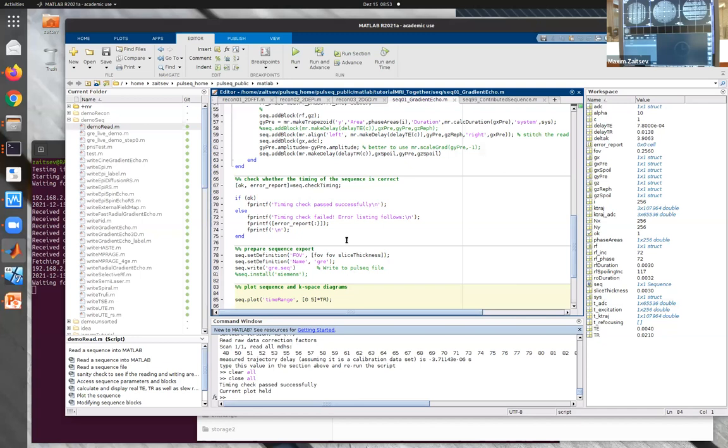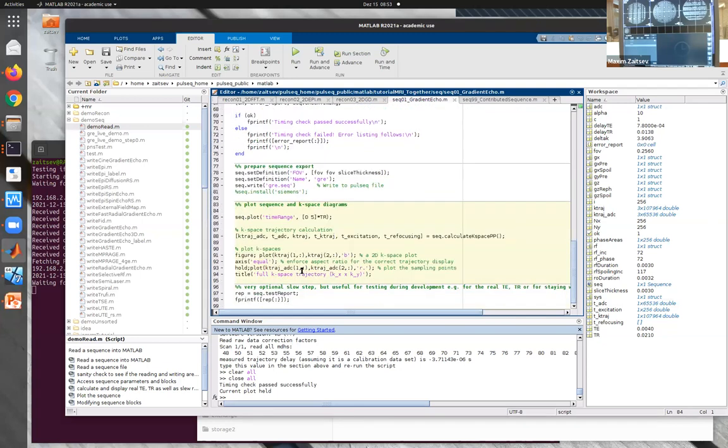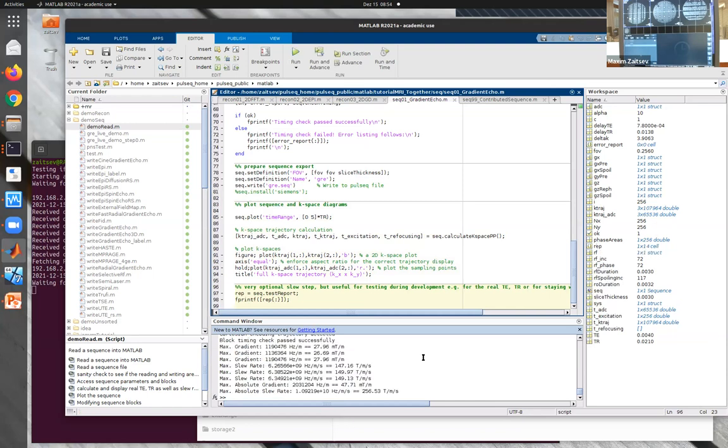So at this point, we can also do more checks, and this is actually relatively slow because it will now generate the entire timing and look into many details of the sequence. It's called sequence report, and this function tries to figure out what your sequence is doing in different ways. It will also check the maximum slew rates and whether you actually stayed within limits. So let's have a look at the output.